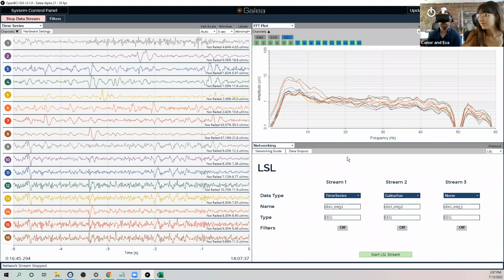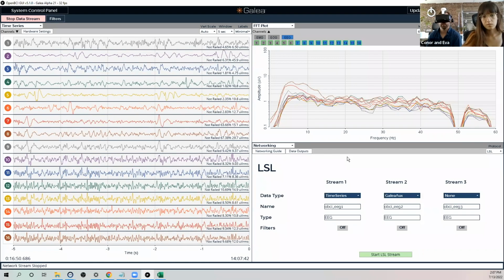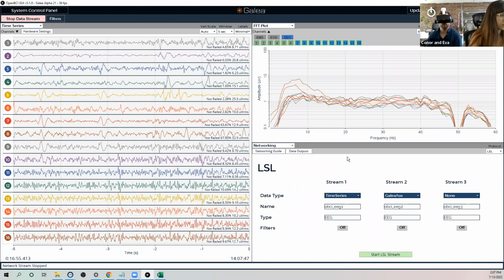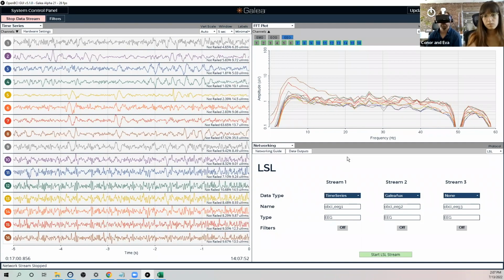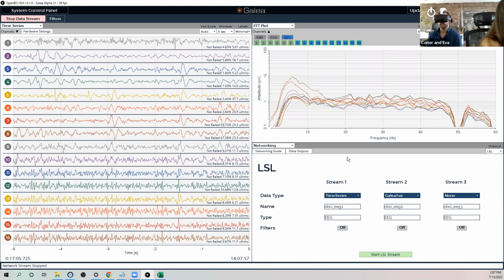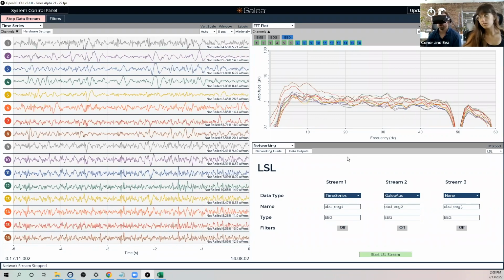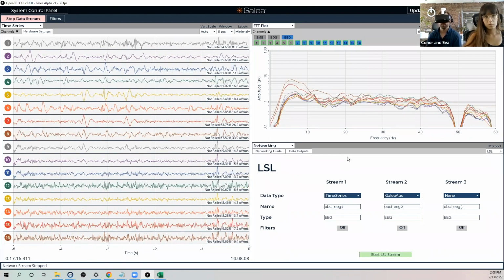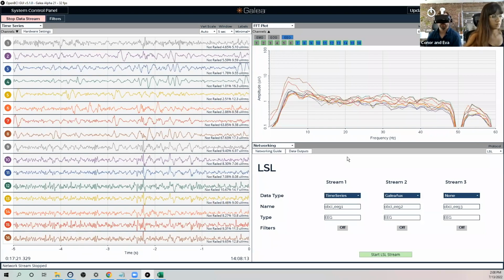So right now we're growing the data science team at OpenBCI, and one of the main goals over the coming year is to build a kind of high level internal state decoder that is generic and can be applied to anybody that puts their head into a Galea system for the first time. So the idea here is that we have a basic suite of high level internal states of mind. So cognitive workload, arousal, stress, fatigue, concentration, these kind of constructs that we typically only understand as qualitative.